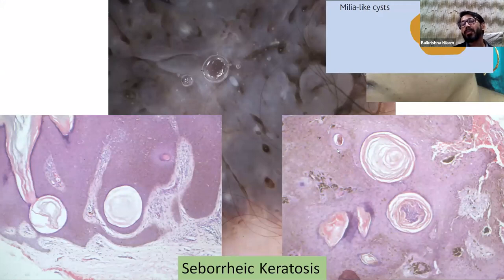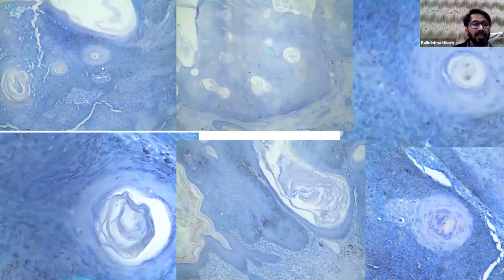Inside that, there are remaining normal squamous cells which are trapped in the basaloid cells and they form the keratin. So wherever there is a stratum corneum or pseudo-keratin pearls, surrounding that there are squamous cells. These squamous cells are non-pigmented, the rest of the basaloid cells are pigmented, and these squamous cells are imparting the white color.